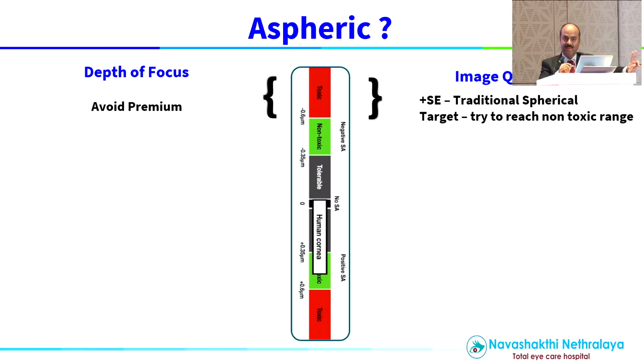Now what are the two values that we have to take home? One of them I said, if it is image quality that you are concentrating on, leave this patient with the spherical aberration of 0.1. That is, you are using a trifocal IOL, you are using some kind of spherical aberration, look at the cornea, do not go by the company, look at the cornea, look at the spherical aberration and match it to this. This is what I am doing off late. I have 3 different trifocal IOLs.